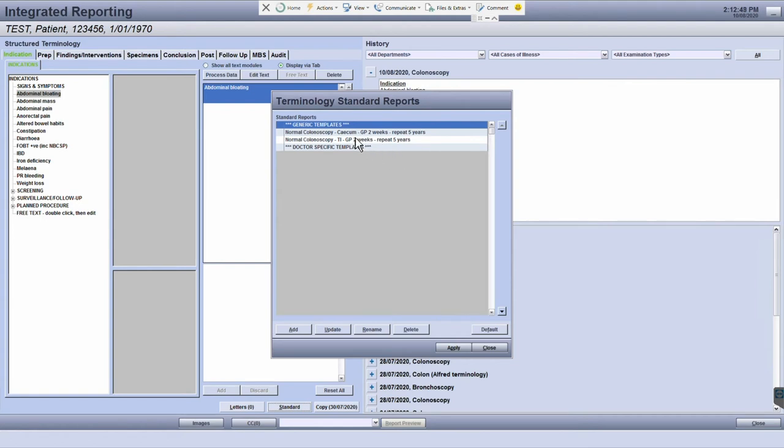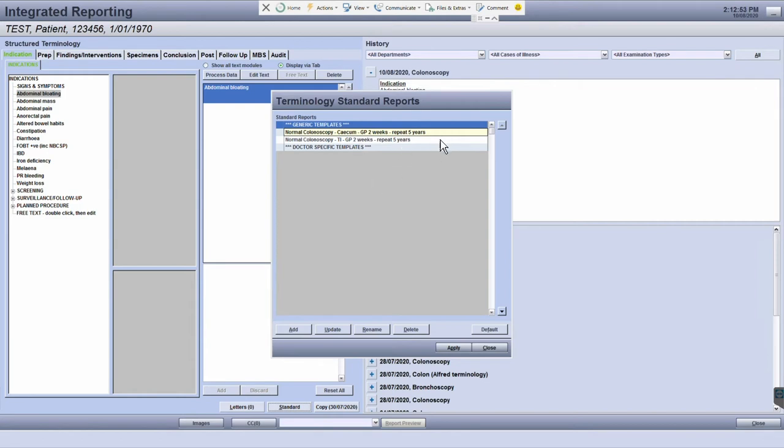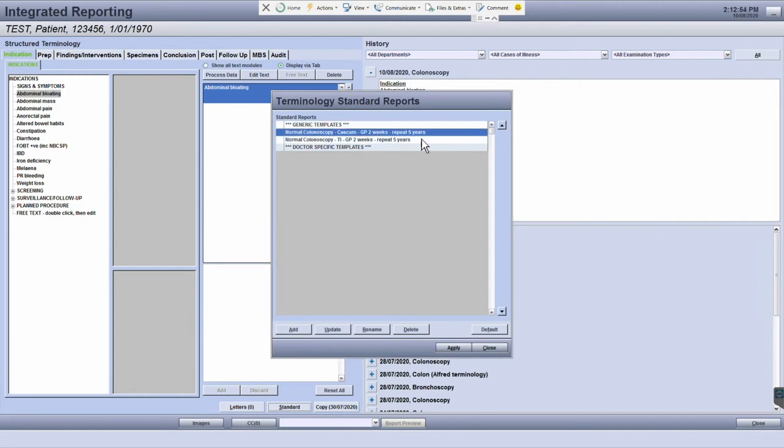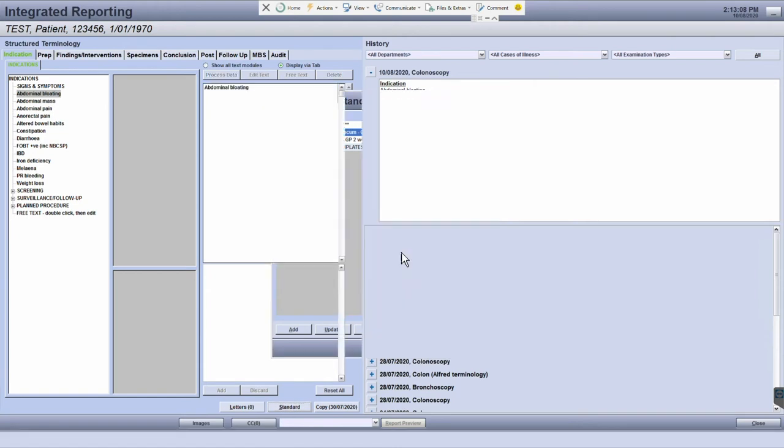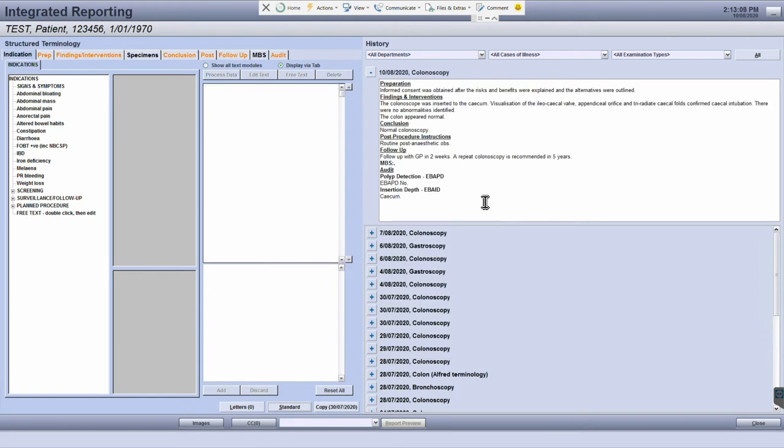Select the report that you wish to use from the list and then click the apply button. If any text is already present in the report, this will be overwritten if you click yes.